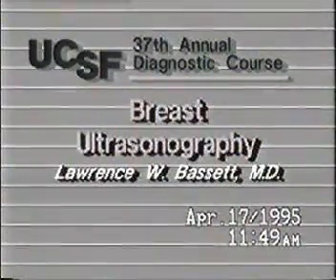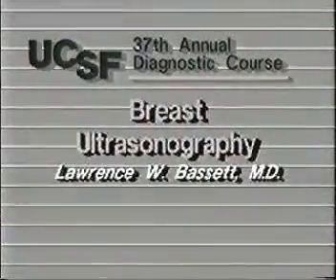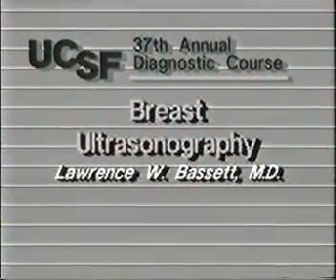We'll look at some of the technical aspects of performing the examination, the current indications for breast sonography. Then we'll look at some normal and abnormal sonograms.